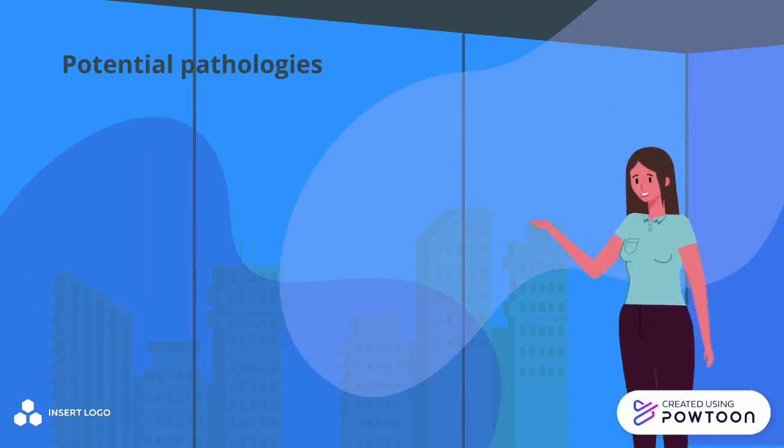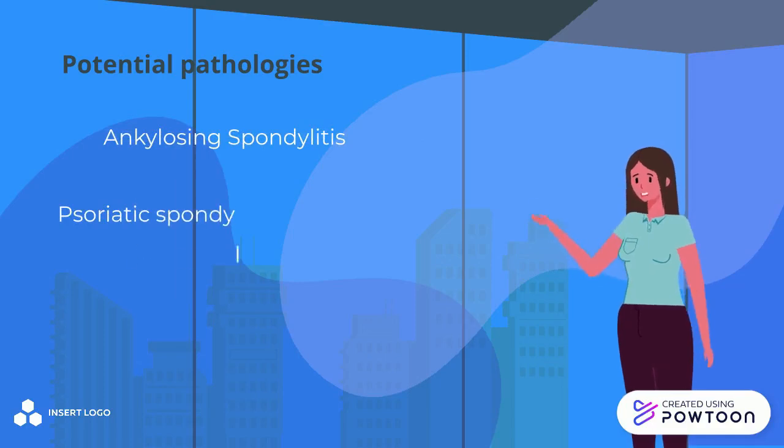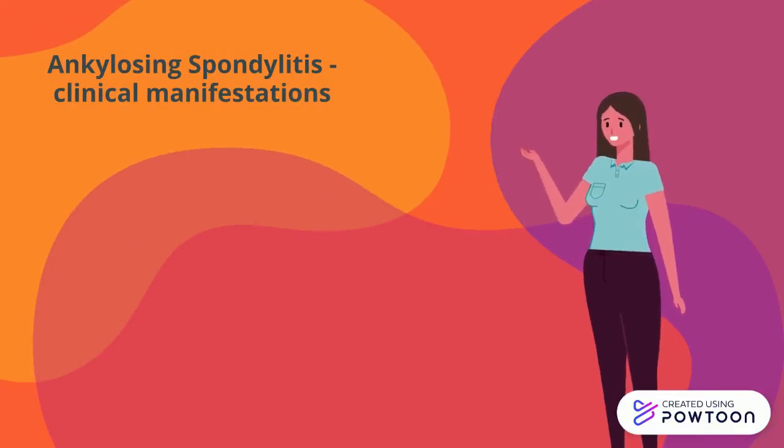After acquiring the requested X-rays, a critique can be conducted on the images to assess the SI joint status. Diagnosis of potential pathologies from the patient's symptoms, guided by the radiographs, could include ankylosing spondylitis, psoriatic spondylitis, and osteoarthritis. As aforementioned, ankylosing spondylitis is a common arthritis.